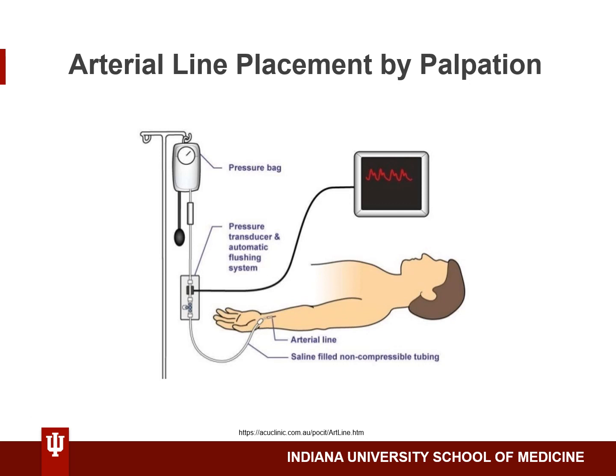Finally, attach pre-flushed pressure tubing to the catheter and secure in place with adhesives. You can verify proper placement within the radial artery by looking for an arterial blood pressure waveform on your monitor. Make sure to keep the pressure transducer at the level of the heart to get accurate blood pressure readings. You're now ready to use your arterial line during your case.